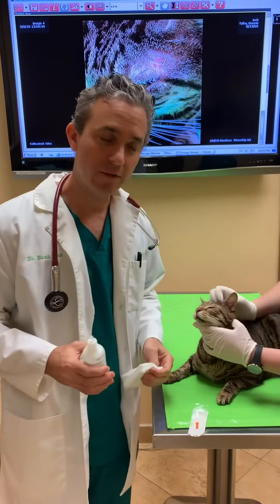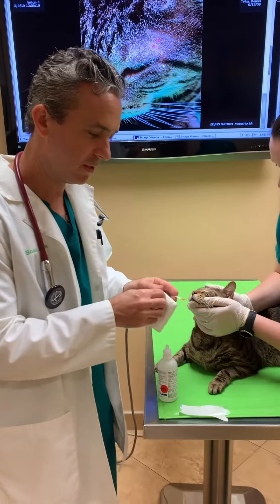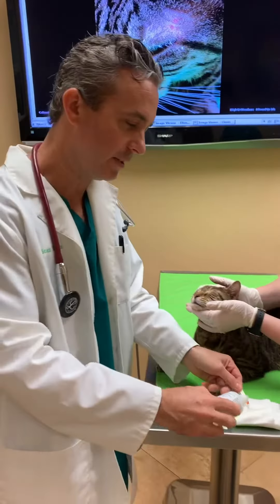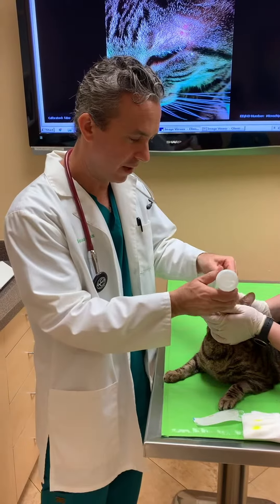Now we're going to perform what's called a fluorescein eye stain. The purpose of this is to stain the surface of the eye — the cornea — to see if there are any scratches. I'm going to use a sterile eye wash and apply a drop of this in his eye.